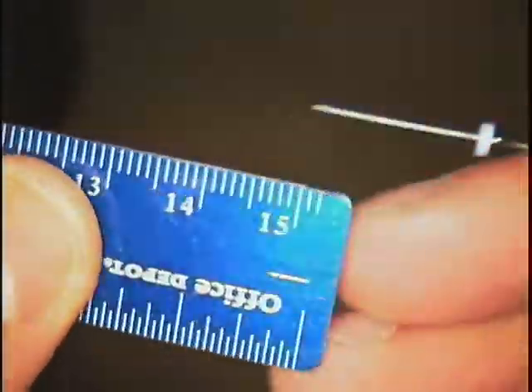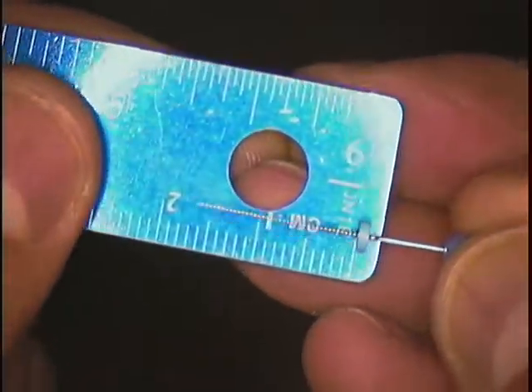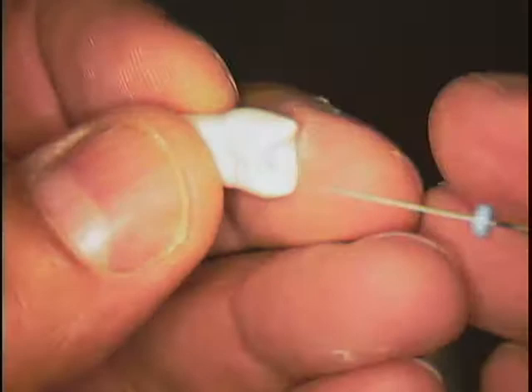And on each file you'll see there's a blue color stopper, or a file stopper, and it's right here. Now, the other thing you're going to need to have is your ruler, your little measuring device. Okay, so one side it's all inches, the other side it's meters, or millimeters. So I'm going to suggest be careful. Don't stick your finger out the end here and think you're going to push that way. You'll go right into your finger, and then you'll need neosporin.